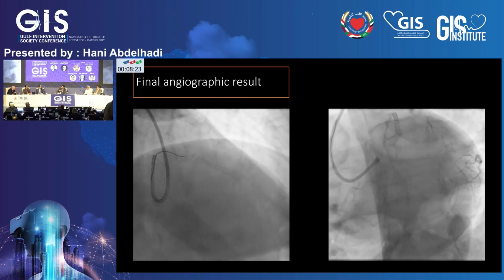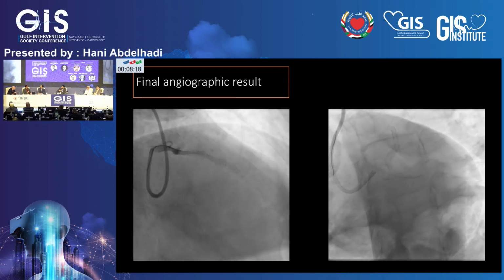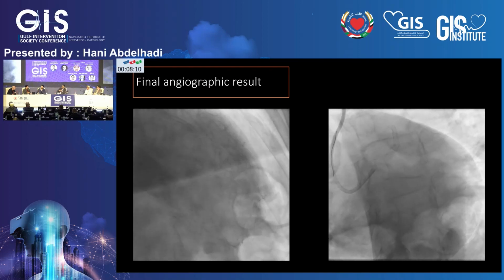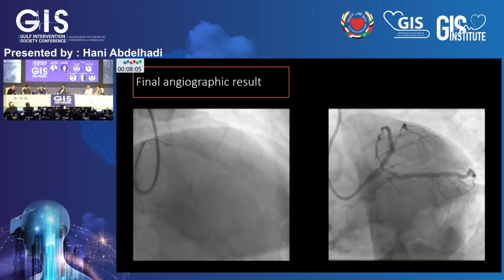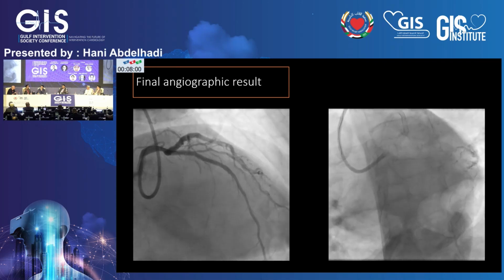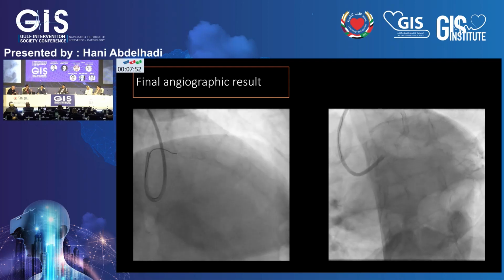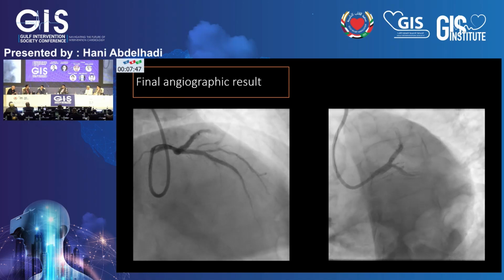Yeah, so I'll make a very important disclaimer there, and that is the length of dissections which are at the edges of the stent have an entirely different flow pattern than the edges of a dissection in a drug-eluting balloon, right? Because what you're doing is you're creating a high flow system that leads into a pocket. And so then the flow wants to go into the pocket to further extend the dissection. That doesn't happen with a drug-coated balloon or, in fact, a CTO dissection, because the blood doesn't really care which path it takes. It just can't have a blind ending tube. If you have a blind ending tube, it creates a hematoma.